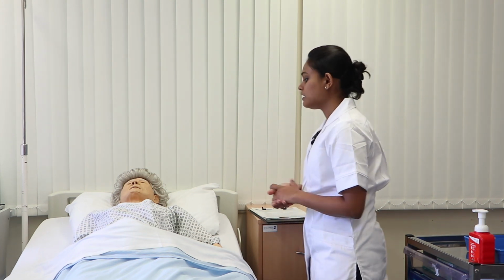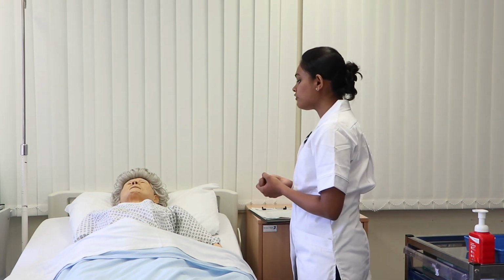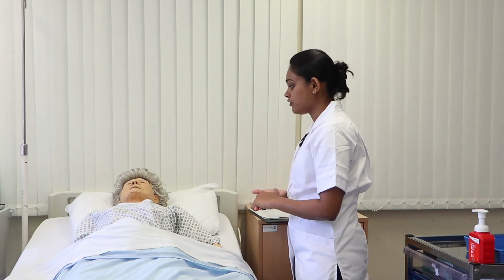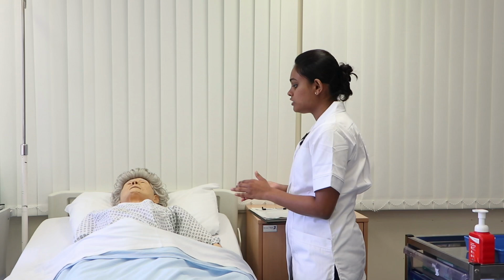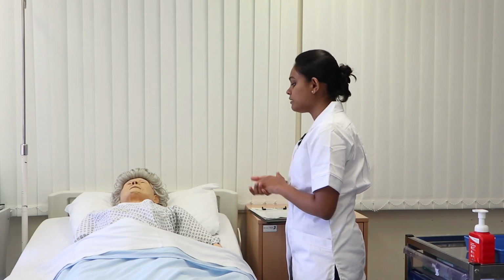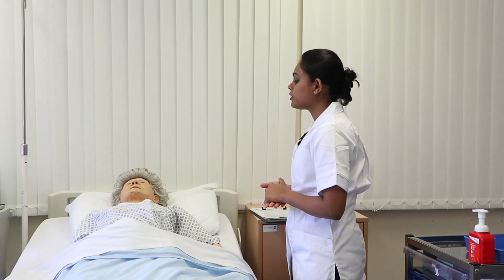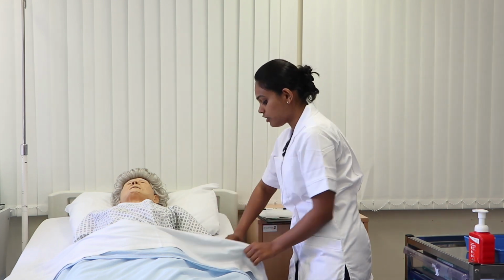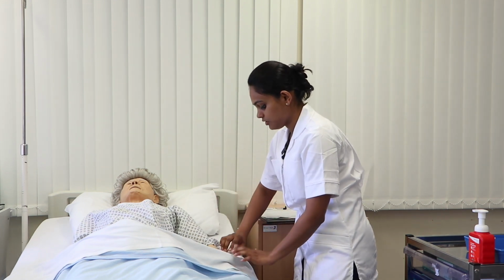Okay, and while removing that, you may feel some discomfort and pain, but you don't worry, I will do it as gentle as possible. Is that okay for you? Yeah. Okay, are you happy for me to do the procedure? Yeah. Is it the right time for that? Okay, now I am going to prepare my materials. Meanwhile, if you need me, please press the call bell. Here is your call bell, Grace. Okay.